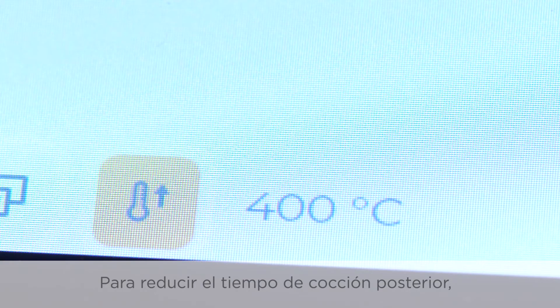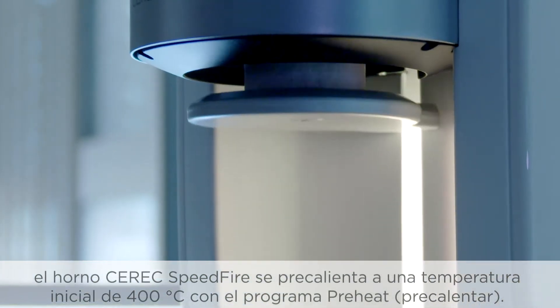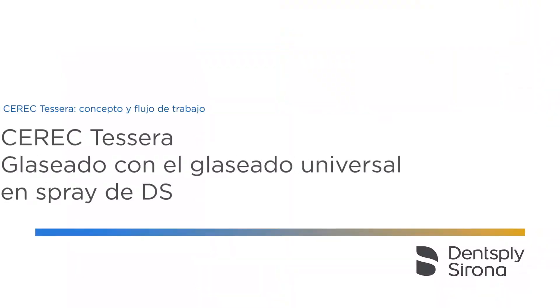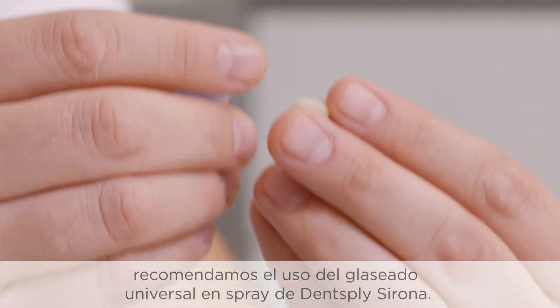To shorten the subsequent firing time, the Seric Speedfire furnace is preheated to a starting temperature of 400 degrees Celsius in the preheat program. For the fastest and most effective results, we recommend the use of Dentsply Sirona Universal Spray Glaze.